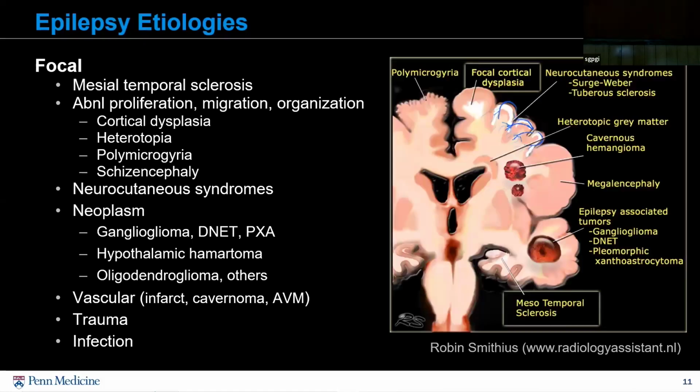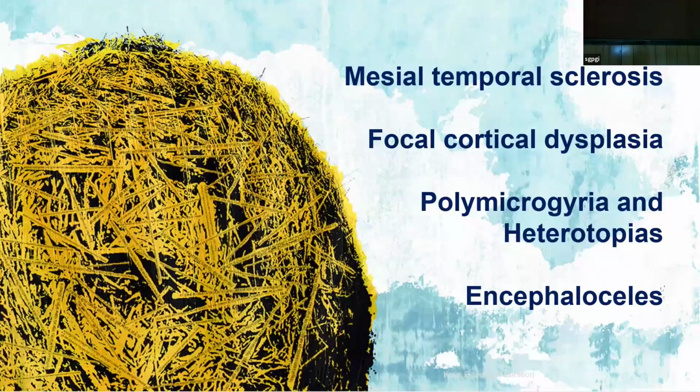Here is a wonderful illustration from the Radiology Assistant website with all of these focal lesions in one particularly unfortunate individual. I'm going to spend the rest of my talk on the following lesions, which I'm most preoccupied with finding and are commonly missed. The needles in the haystack, as it were, with this drawing from the same illustrator as the title slide.